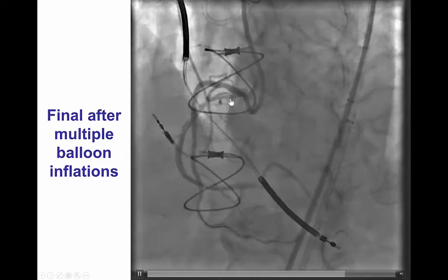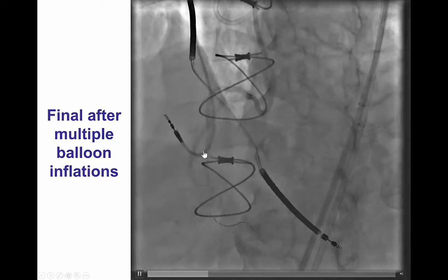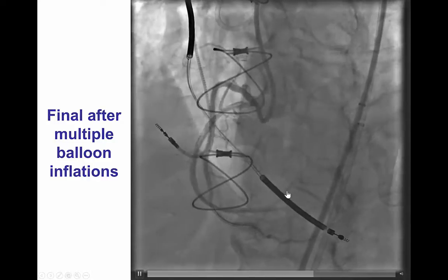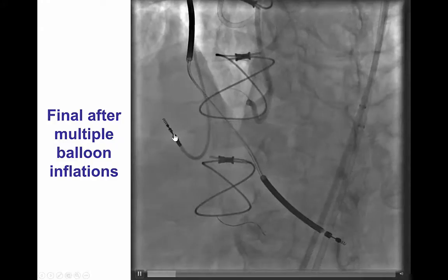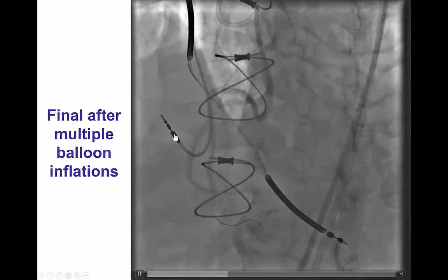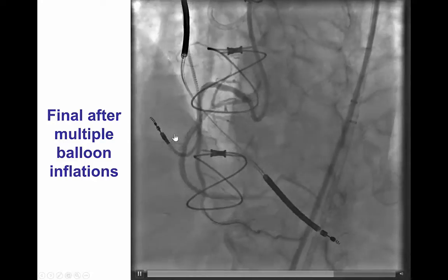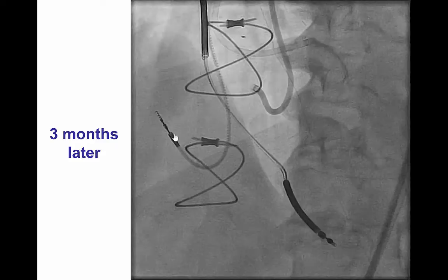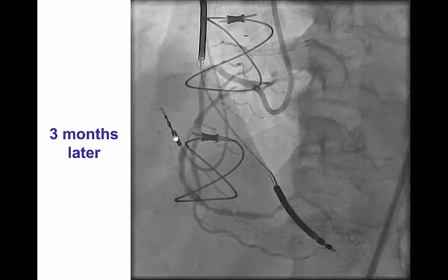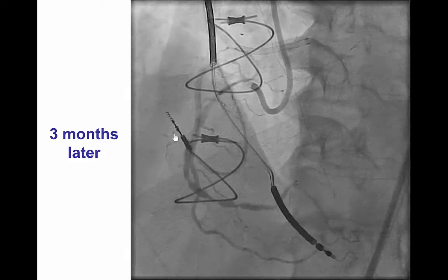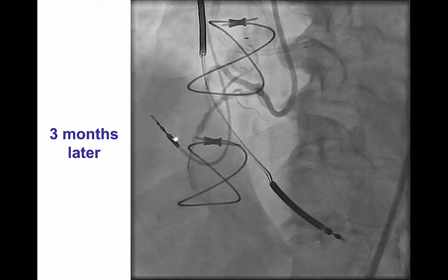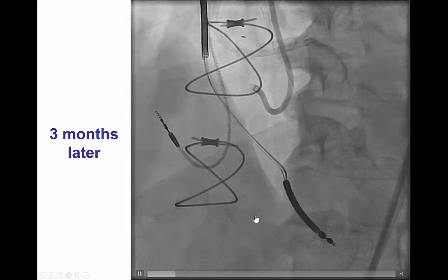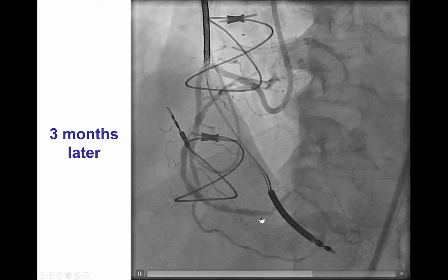After balloon angioplasty, there is antegrade flow all the way to the PDA and the PLV. However, there are significant dissections in the entire length of the right coronary artery, so we did not place stents. The patient came back three months later, and now there was a channel that had formed within the dissection planes.